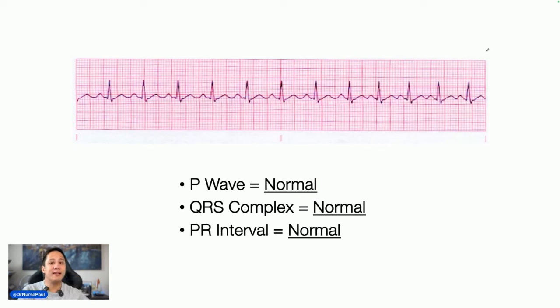What about the rate? Did anyone count the rate? Someone said 110. 1, 2, 3, 4, 5, 6. I have to count it. I don't trust you guys. I'm just kidding. 1, 2, 3, 4, 5, 6, 7, 8, 9, 10, 11, 12.